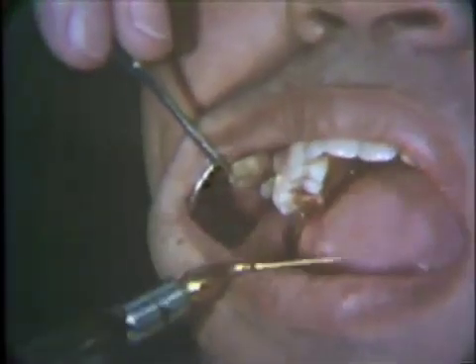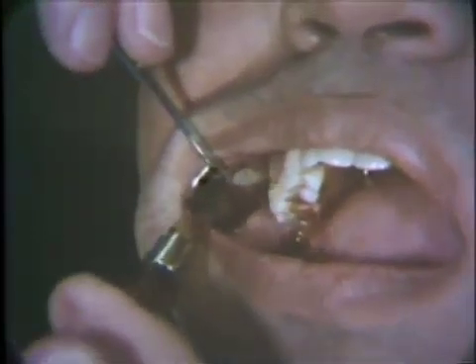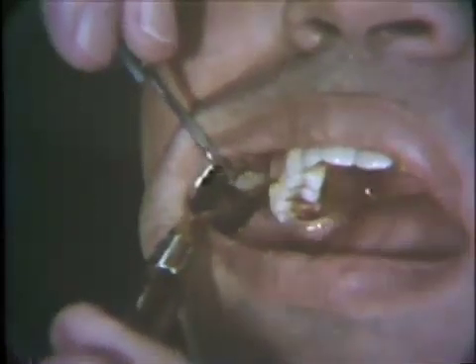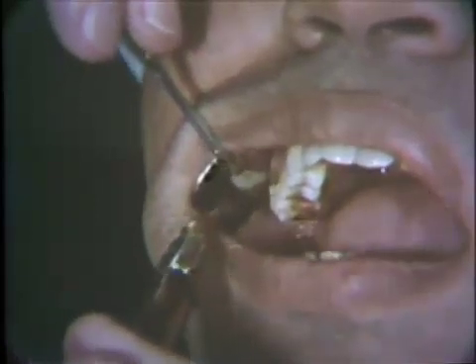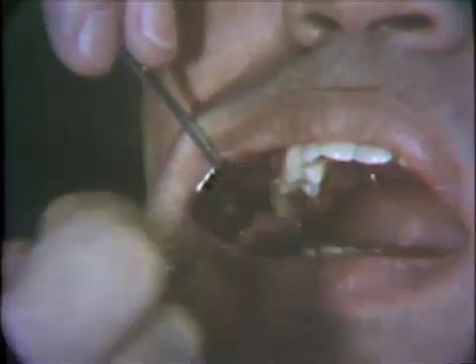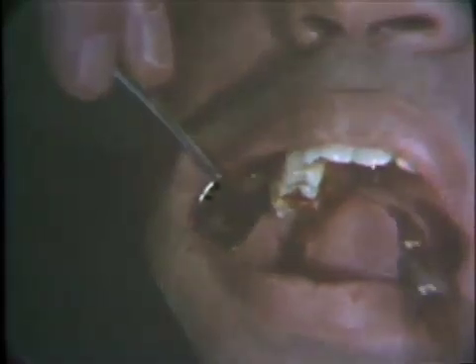After the completion of the scaling and root planing, iodine lotion should again be applied into the periodontal pockets to minimize the hazard of post-operative infection.